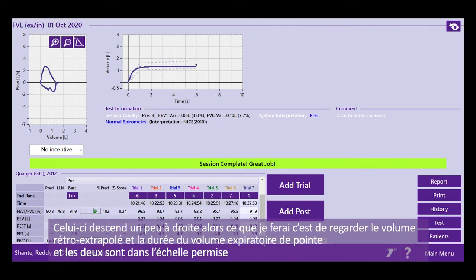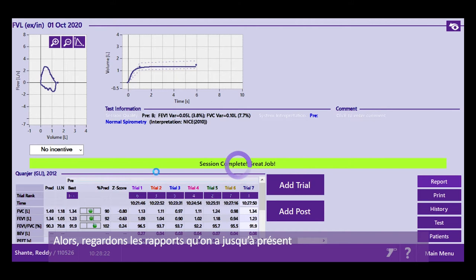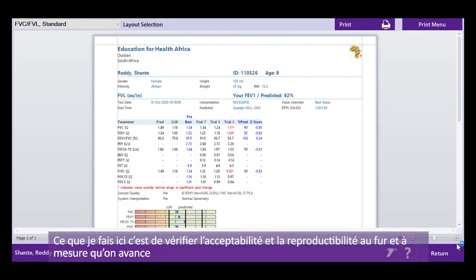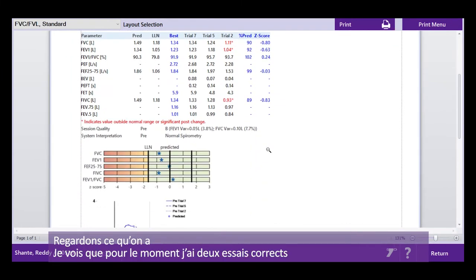So this one is falling fractionally to the right. So what I would do is definitely look at my back extrapolated volume and my peak expiratory flow time, both of which are within the allowed ranges. So now I'm looking at my forced inspiratory vital capacity against my forced vital capacity, and that is looking very, very nice. So let's look at the report that we have to date. So what I'm doing is I'm checking acceptability and repeatability as I go along. So let's see what we've got.